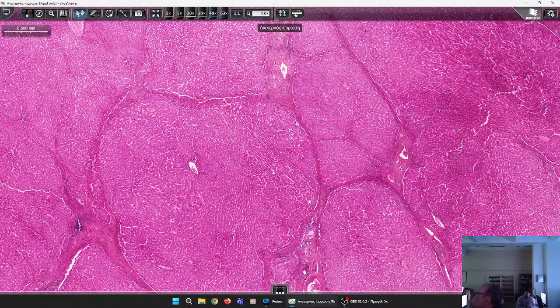Not only can't you see active steatohepatitis, you can't even see steatosis. 0% steatosis. But what caused the cirrhosis in the first place is NASH, or MASLD. It used to be called non-alcoholic fatty liver disease. It's what we call burnout.